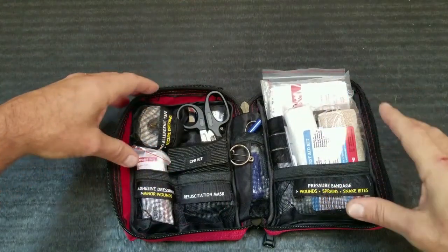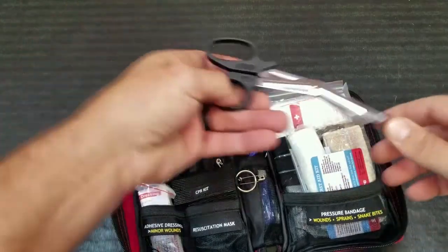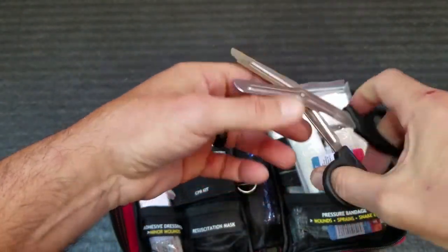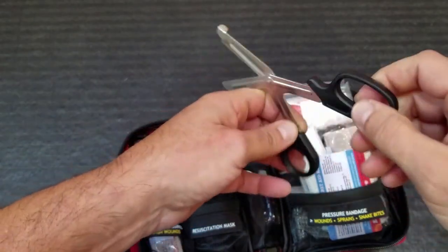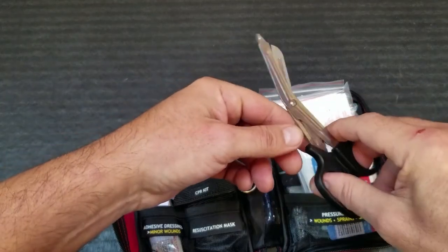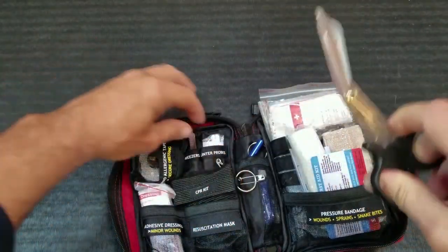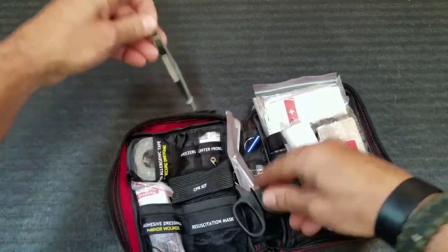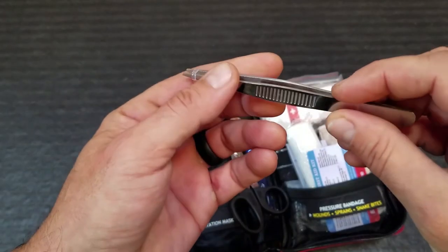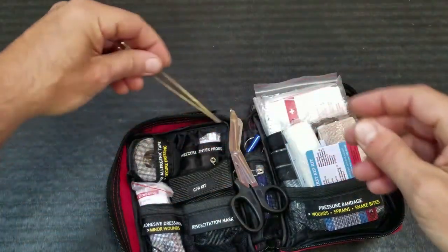Not only is the case and the setup impressive, but the actual components inside as well. For example, these shears or scissors here — these are quality stainless steel scissors, not some little garbage that looks basically like a toy you'd give to a child because you wouldn't have to worry about its sharpness since it wouldn't cut anything. Other little things like tweezers — you're getting real tweezers here, not some little garbage component that they're just including so they could list it on the specs.